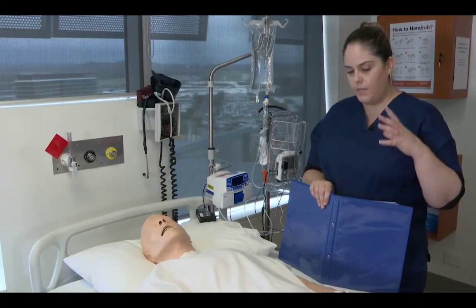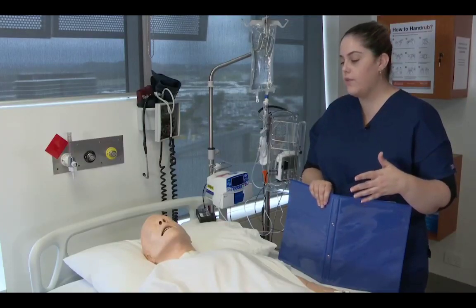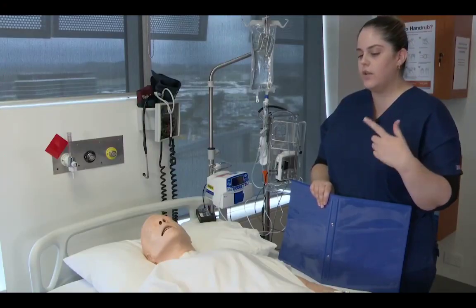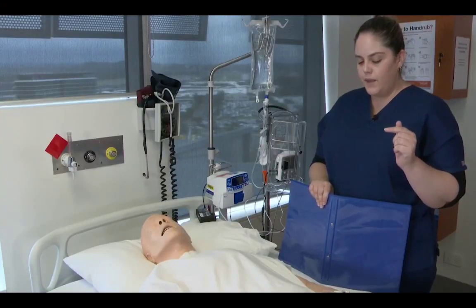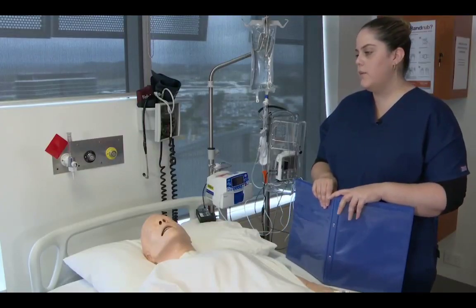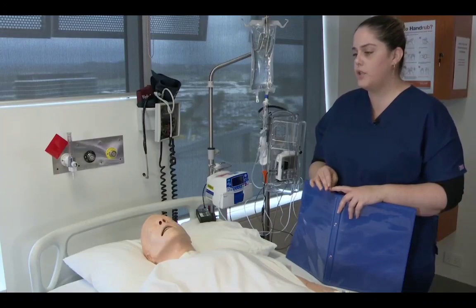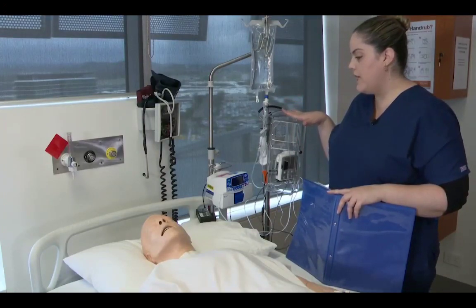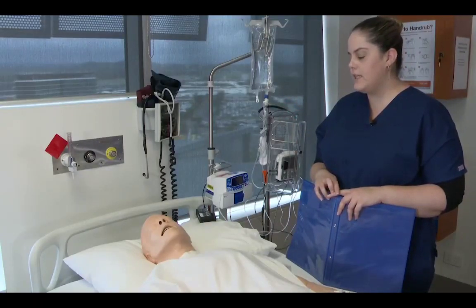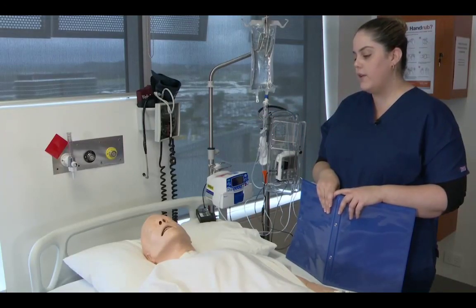So essentially, as we said, you've had this operation done. You will start to have pain potentially coming on after those blocks wear off. And so this PCA is here so that you can control your pain relief from here on out. The risk of this medication, fentanyl, is that it is a respiratory depressant. So by that we mean that it can cause your respiratory rate to drop. We make sure that we monitor you very closely, and we also set up the machine in such a way that you can't have too much of the medication. We also make sure we're checking back very regularly to see how much you're using, and we will set you up with a set of nasal prongs, so a little bit of oxygen to go via your nose.